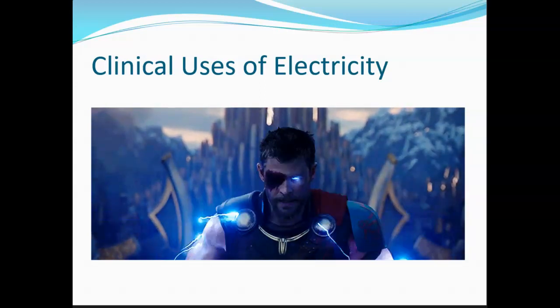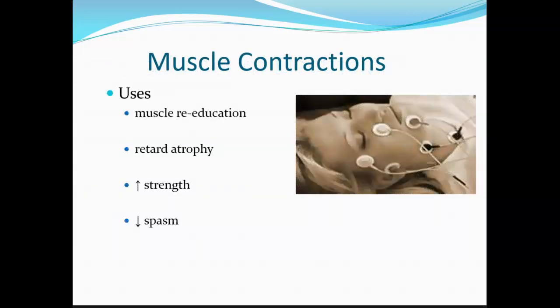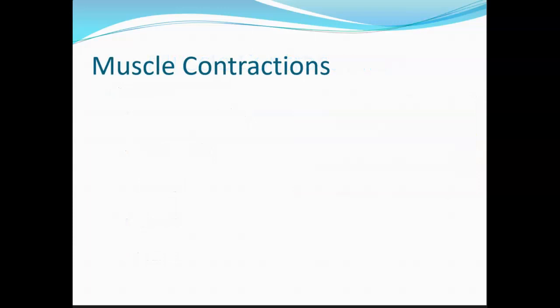This is not why my videos are going to be so long, so don't worry about that. This first one is just the intro slide, and you have this in your handout. Muscle contractions and pain control are two things that we know e-stim does. You can't argue with that. The argument comes in is it helpful to the patient care and to their outcome? That's the one that's up for debate. We're going to break these down, and muscle contractions are where we're going to start.